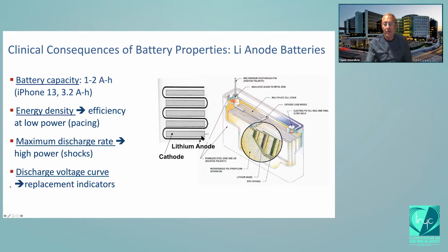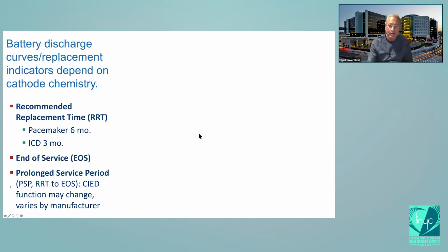And when you hear somebody has a battery problem and some of the batteries fail unpredictably, it's often, although not always, a problem with separator perforation or some other area in which the lithium and the cathode make direct electrical contact as matter is deposited on the cathode during the course of the battery depletion.